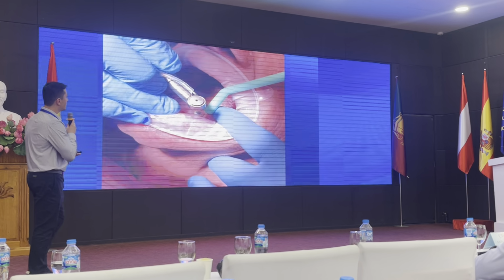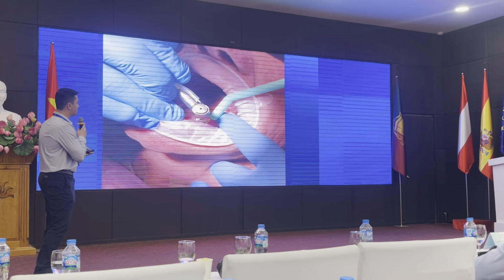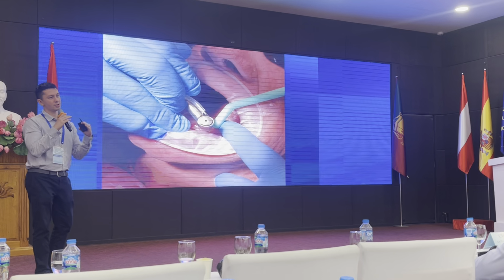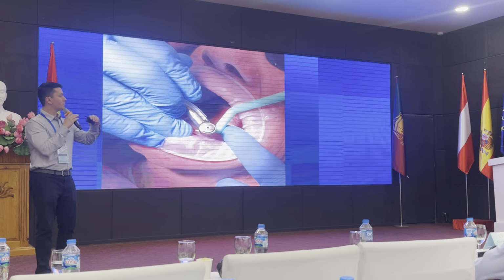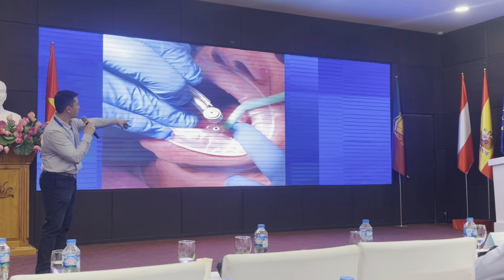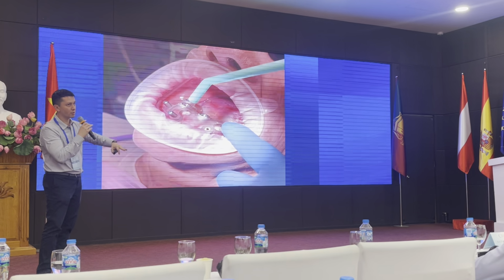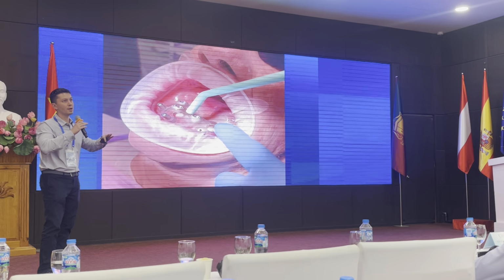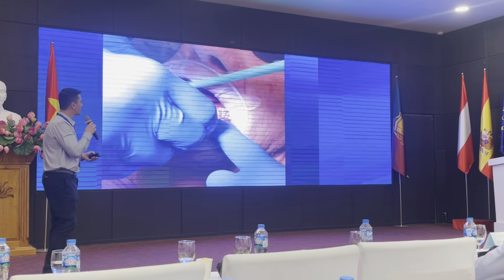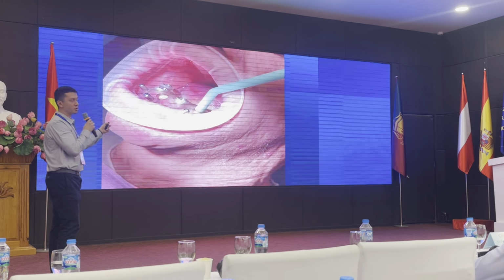So this part is purely dependent on the guide sitting stable on the soft tissue. And a lot of times it's me holding the guide with my hand and my assistant with her hand, she's pushing on the other side. So we're both helping to keep the guide stable. These are the least accurate types of surgical guides you can have because it's totally soft tissue dependent.